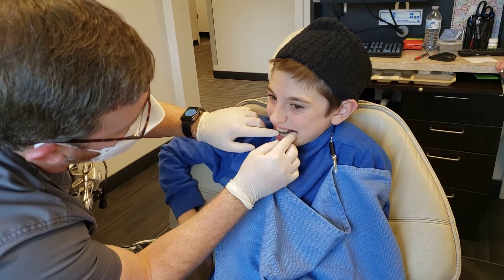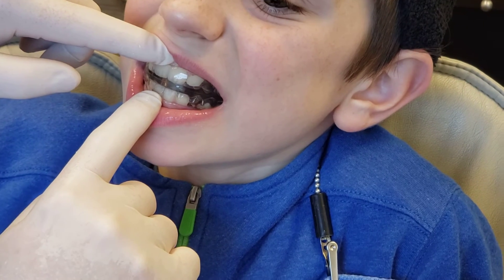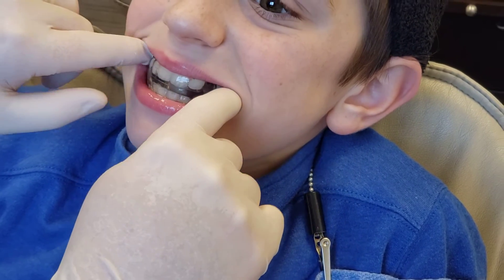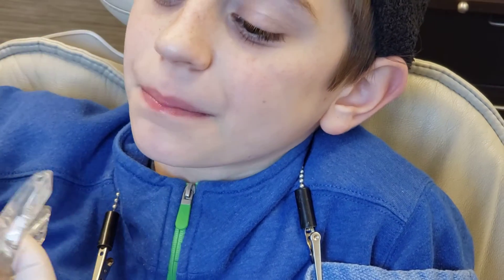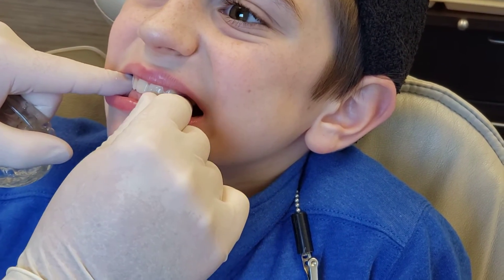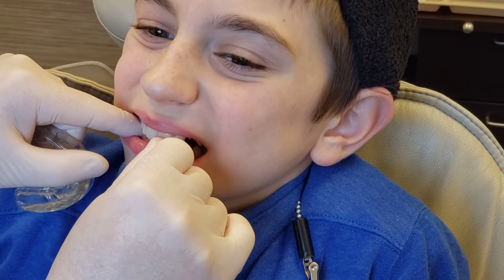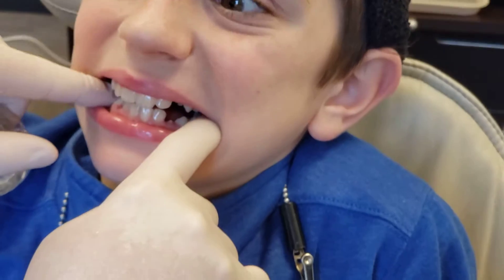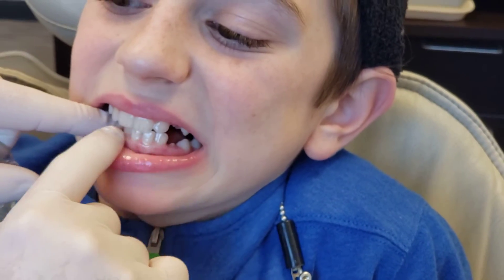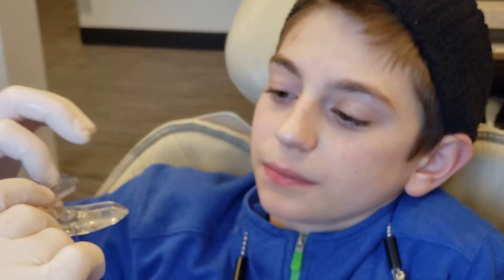Notice there's a lot of space back here — these back teeth are not touching the tray. Now bite down without the tray and look up a little bit. See how his back teeth don't touch when he's open a little bit? As long as he's wearing this, it's allowing those back teeth to erupt high enough to correct the overbite. That's why when he wears it, it's not touching in the back.